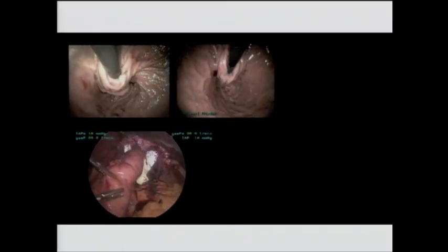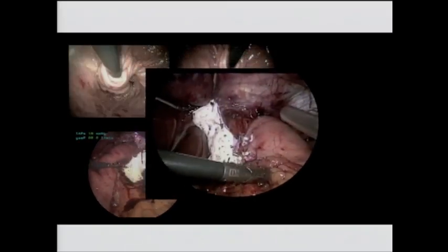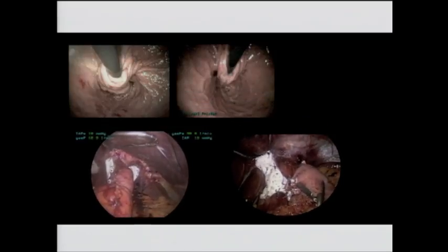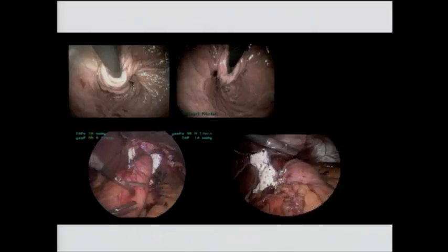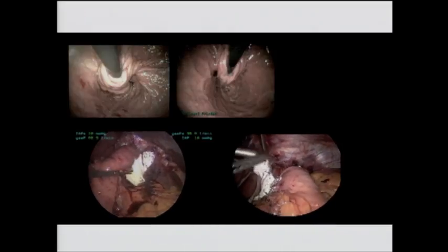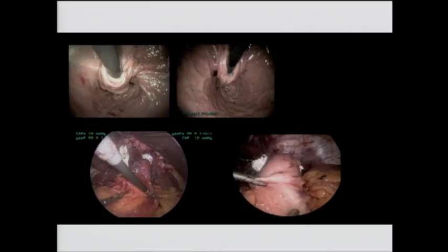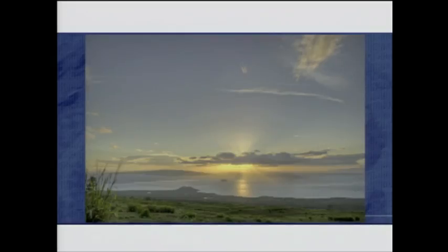If you look at them from the outside, same thing. The difference is hundreds of fundoplications and a difference of experience, and yet she's managed to recreate the exact same operation. So the rest of the video that you would see, I don't think there's anything unusual or not too straightforward. A lot of people may not put mesh in there, but really, I think this technique's primary benefit is that it allows people of all levels of experience to end up creating the exact same operation.